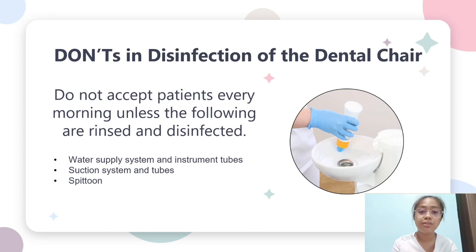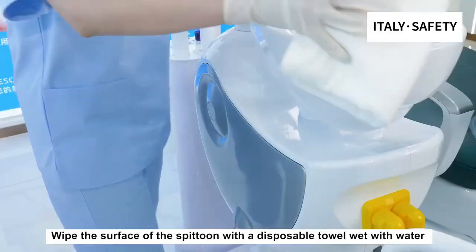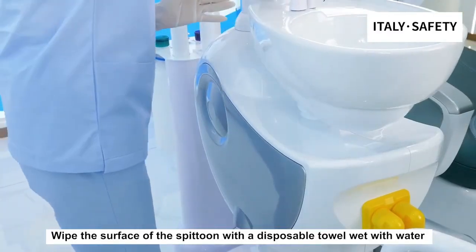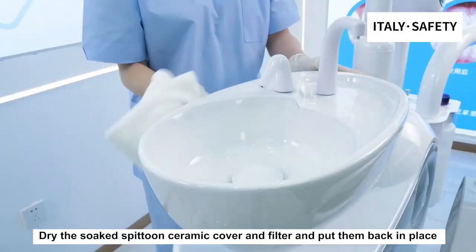The fourth is do not accept patients every morning unless the water supply system and instrument tubes, suction system, tubes, and spittoon are rinsed and disinfected to ensure that it is clean before using it on the patient.